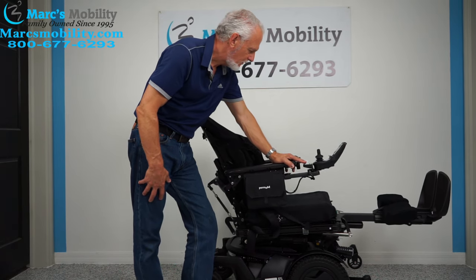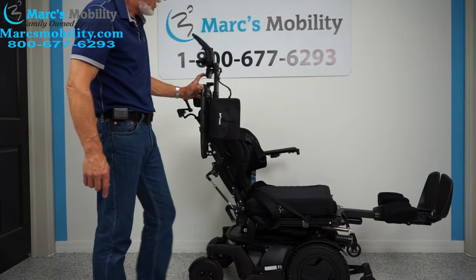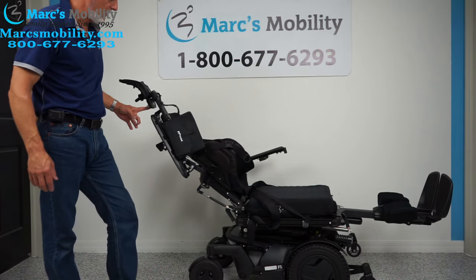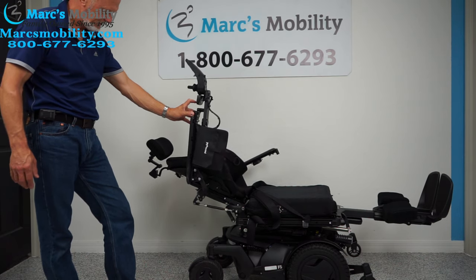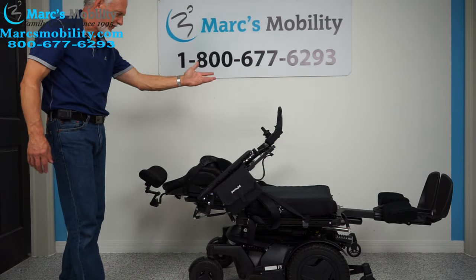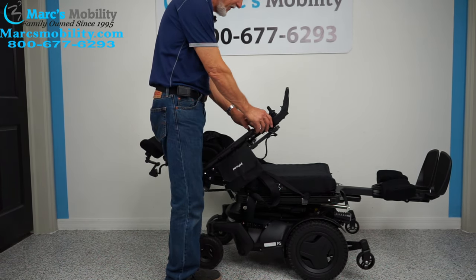The next feature is the electric recline — the back going back by itself. The armrests flip up, so if you transfer from the side you can flip both arms out of the way. As you can see, it's pretty much a full recline. Now I'm going to bring the recline back up and bring the feet back down.